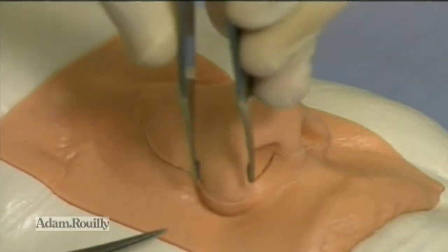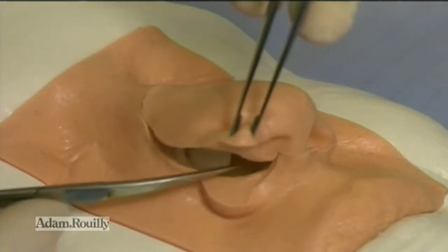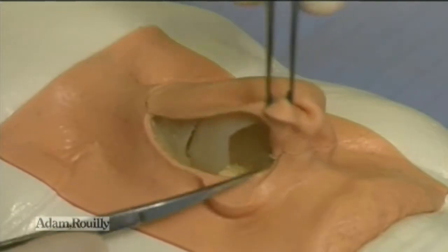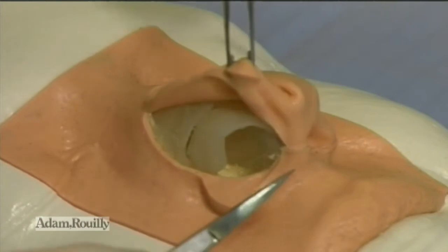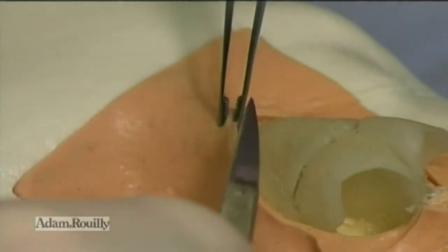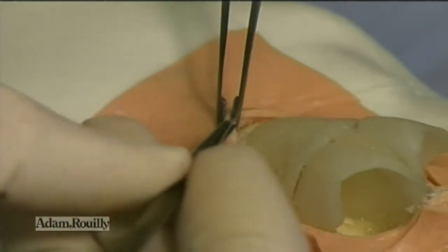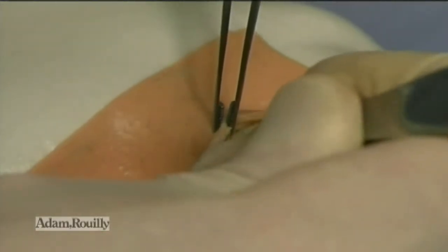The model is amenable to both open and closed rhinoplasty, but for the purpose of video recording we are going to do this as an open procedure, and we are also going to lift the soft tissue envelope off the nose to reveal the cartilages underneath. We are going to elevate the soft tissue and periosteum, just cutting through the periosteum, that's 7-8mm laterally, so preserving support to the periosteum and to the bone.